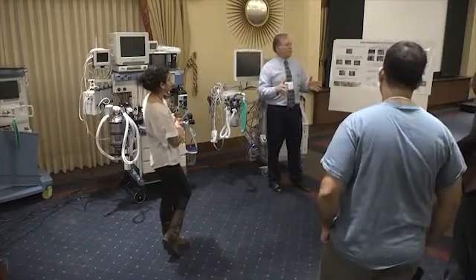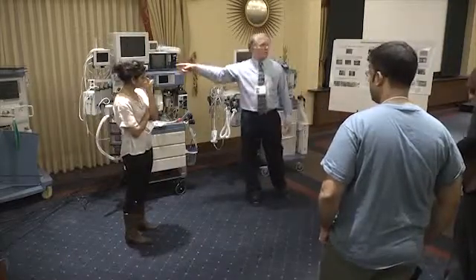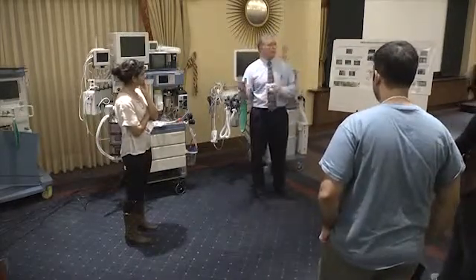So what I would say, when you're thinking about your anesthesia test, start this up, and once that is running, do the other things that you need to do. Check your ambu bag, check your monitors, check this, check that, and your meds.